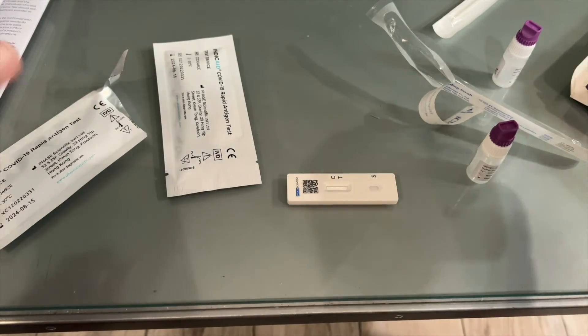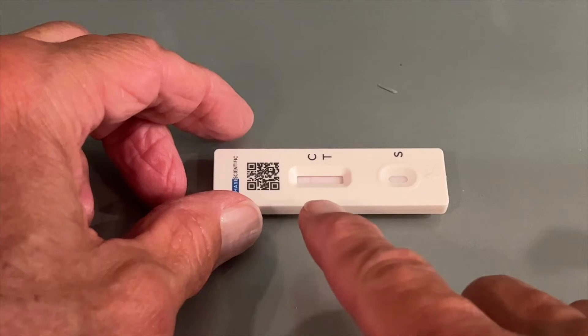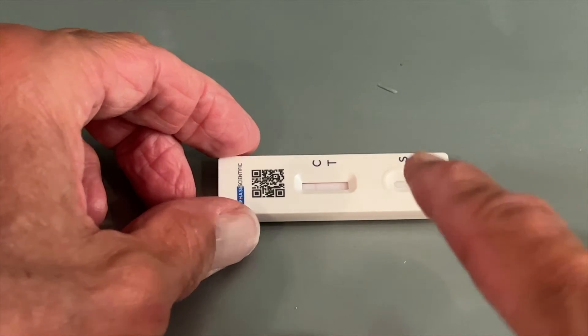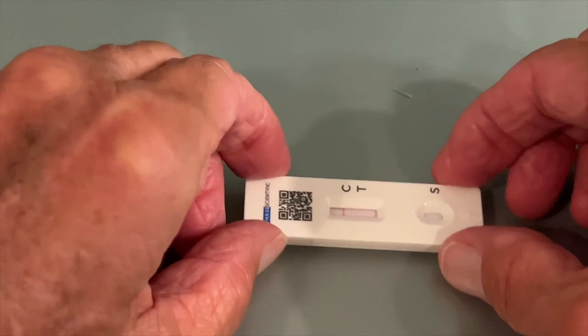So now we just gotta wait and see if I get a positive or negative result. We'll come back in a couple of minutes. We've got to give it 20 minutes — we're only about five minutes in. You can already see I'm getting a little line on the control but nothing over on the test line, so we'll let it play out.